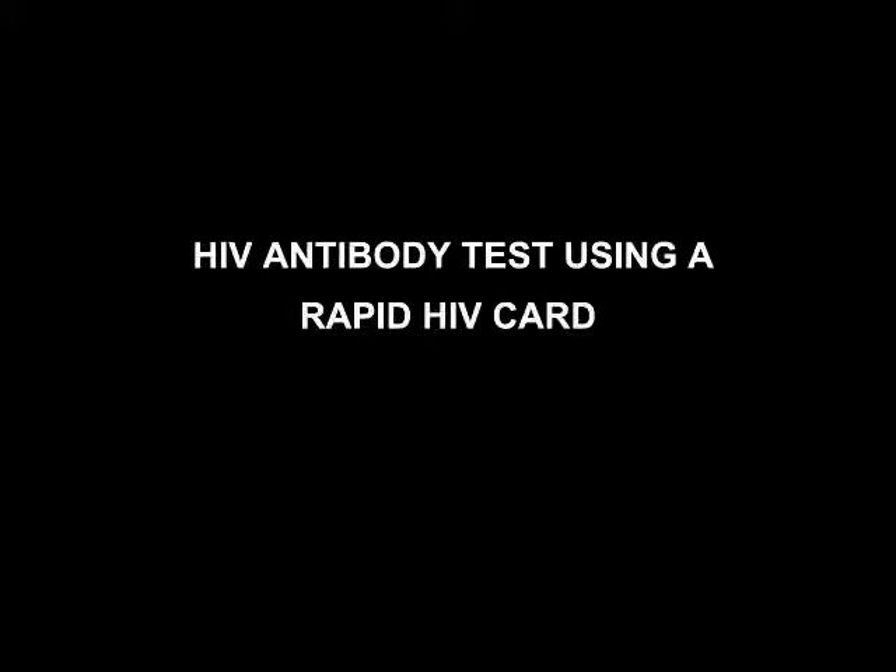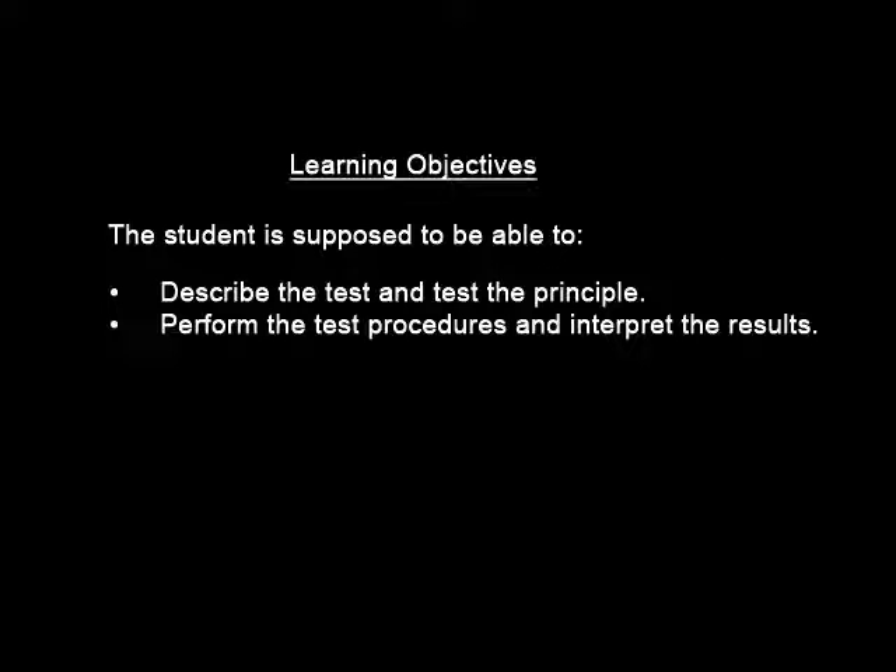HIV Antibody Test Using a Rapid HIV Card. Learning objectives: the student is supposed to be able to describe the test and the test principle, and also be able to perform the test and interpret the results.